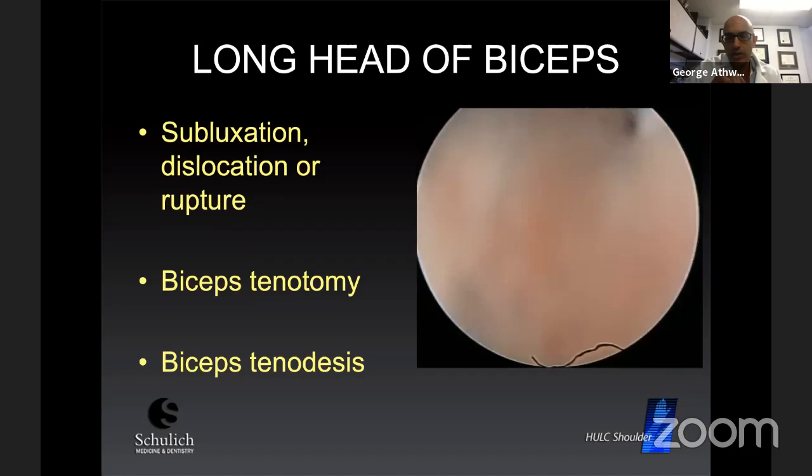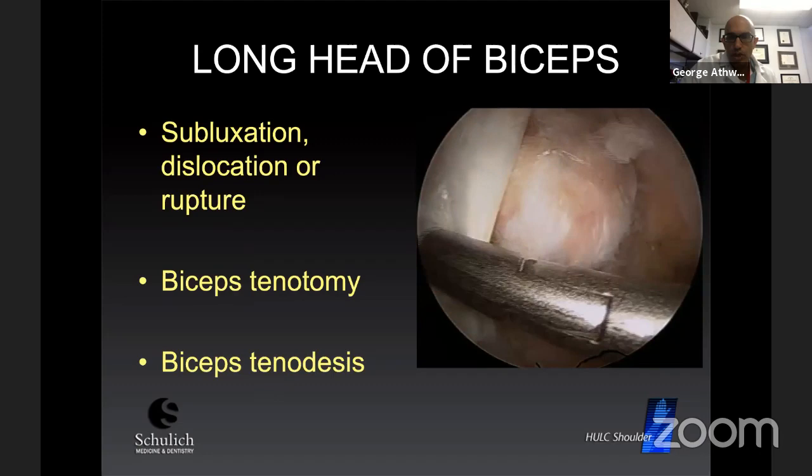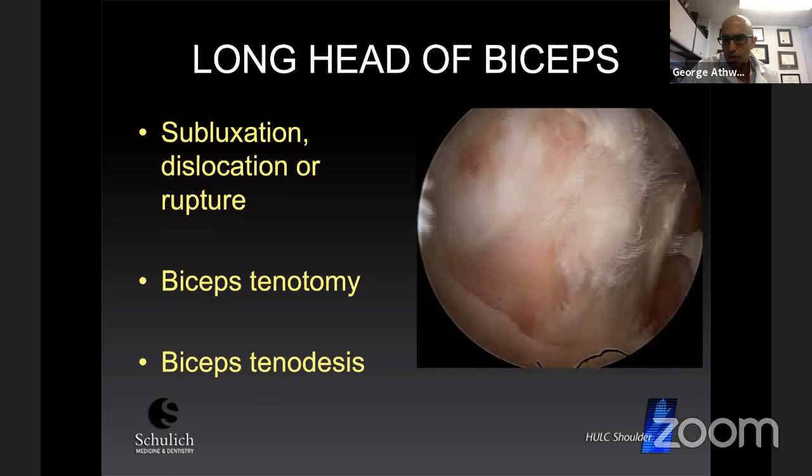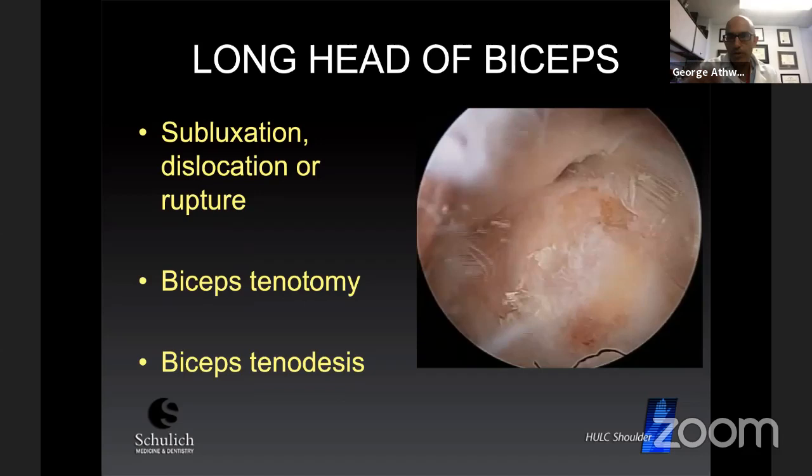You can see here on the video on the right, there's the biceps groove. There's the lesser tuberosity. This is the dislocated, hypertrophied long head of biceps. We're going to bring that back over and put it back into the biceps groove. I've got a suture anchor in the inferior aspect of the groove, and you can barely see it right there. That's where I'm going to tenodese it. So bring the biceps tendon, reduce it into the groove, tenodese it at the bottom part of the groove, and then you can go ahead and fix the subscapularis tear.